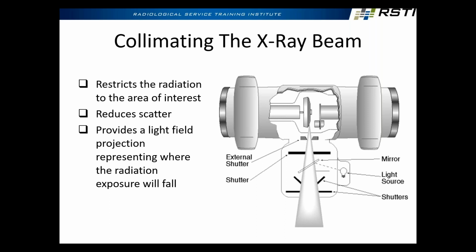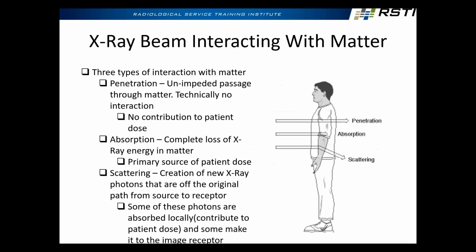So that seems like really, really tight tolerances, but it's not. If you're doing a 40-inch SID, which is typical, that's like 0.8 of an inch. If your system's metric and you're shooting at 100 centimeters, that's 2 centimeters. So you're allowed a pretty big margin. In fact, you're typically allowed way more than the techs will let you get away with, in my experience, on the federal level. All right.